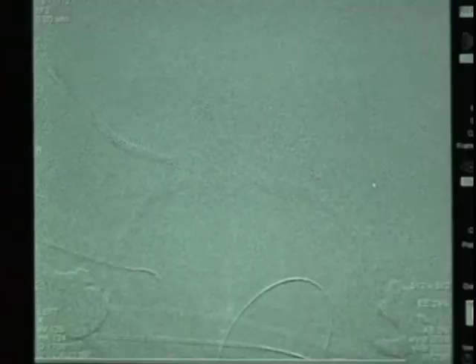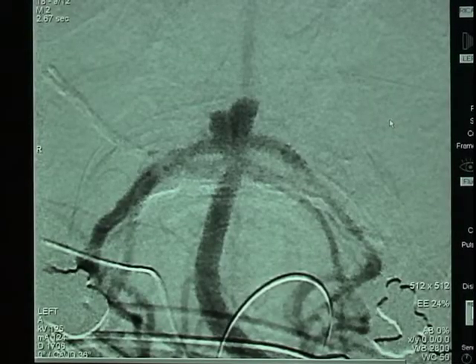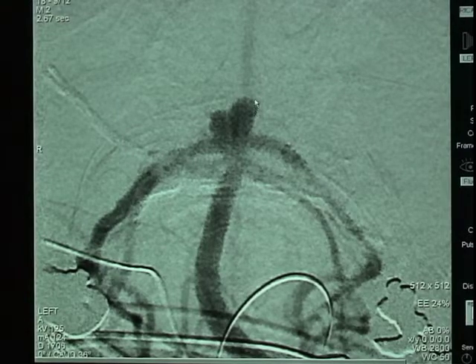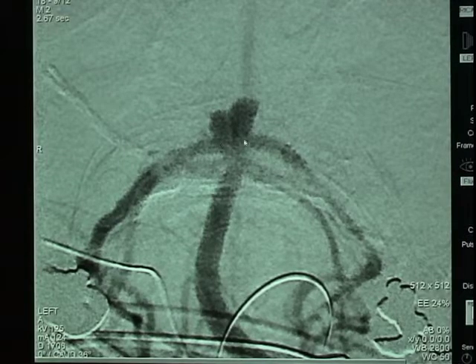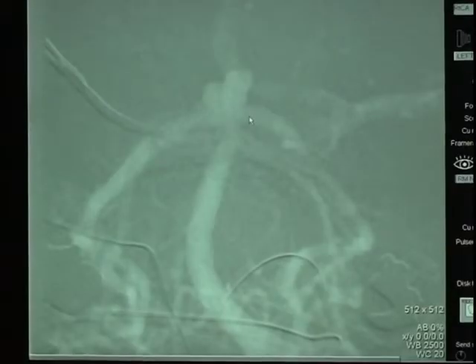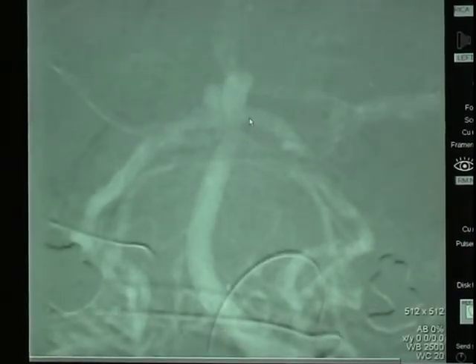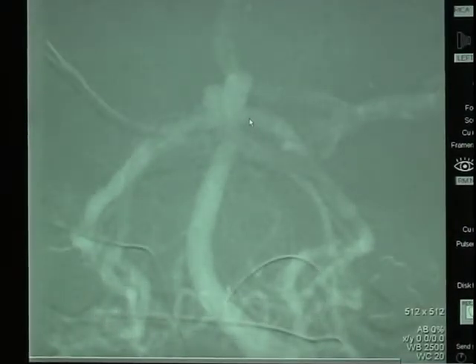Here we see a basilar apex aneurysm that is wide-necked. The arrow outlines the bilobed aneurysm and then points to the wide neck of the aneurysm. Coils will not stay in this aneurysm without using neck remodeling devices or balloons.